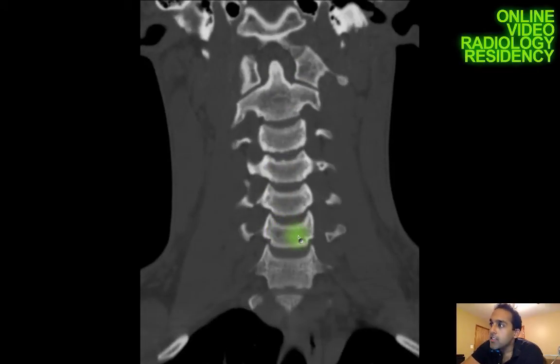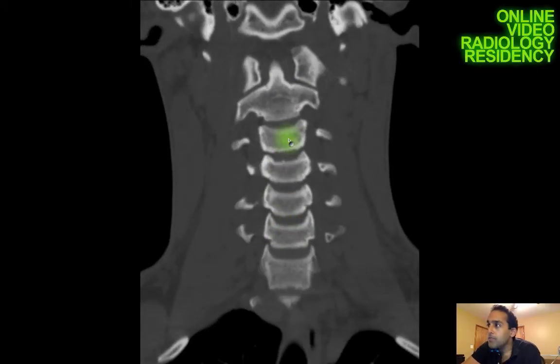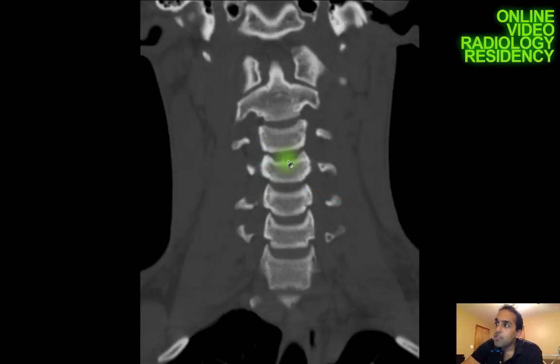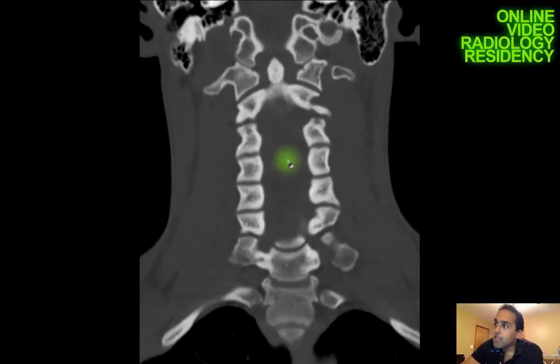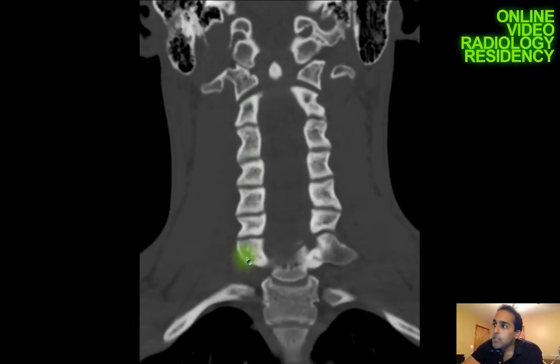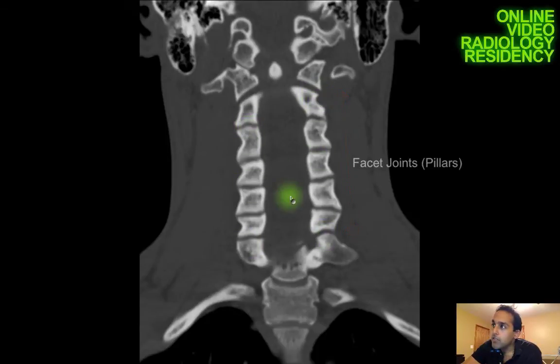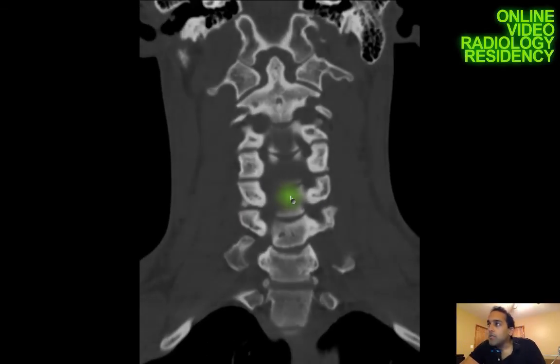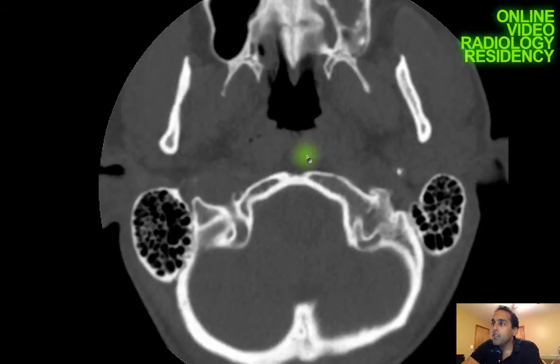The other half of fractures occur at the C6–C7 level. In the coronal plane I can also see the uncinate processes of the vertebral bodies, which are only found in the cervical spine, and I can see the pillars of the cervical spine, which are basically the facet joints viewed in a different plane. All of that anatomy looks very good here.